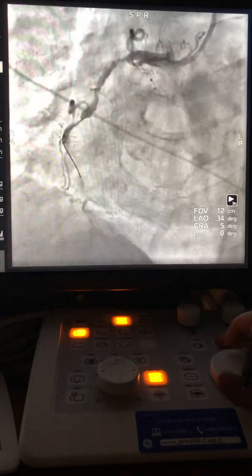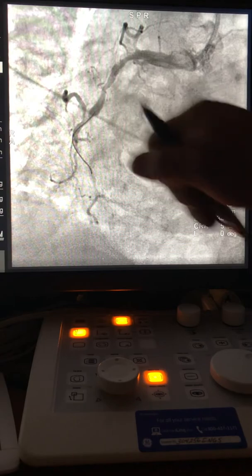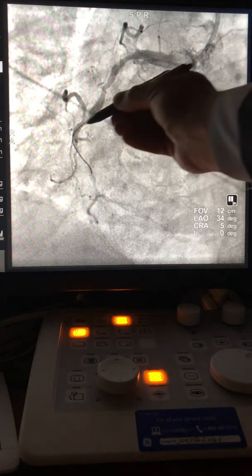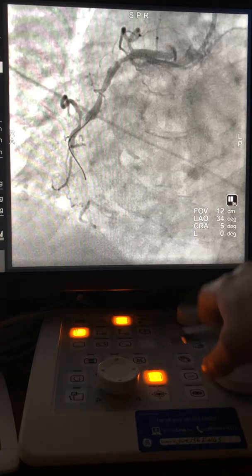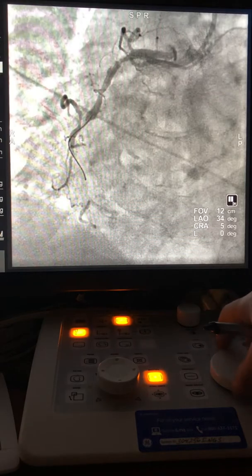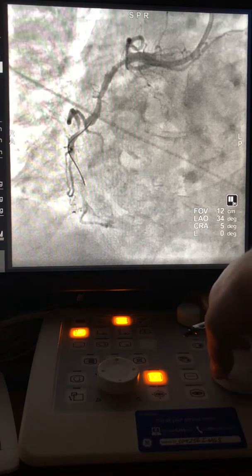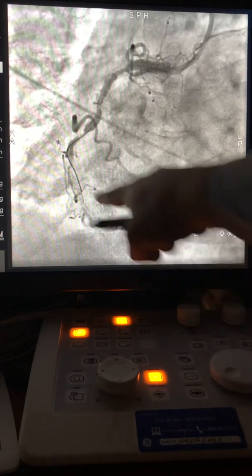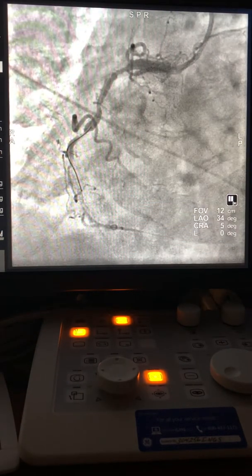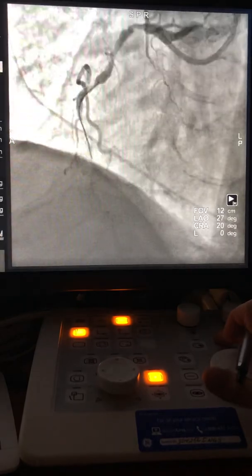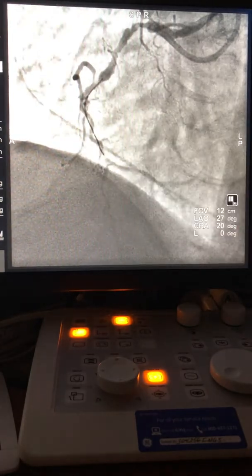Once we dilate, I have to use a smaller balloon — from 2.0 went to 1.25. The 1.25 and 1.5 balloons have one dot; 2.0 and above have two dots. Now you see the wire advancing better here, better here. Then you spin slowly, advance the balloon slowly, spin slowly, and take pictures in different projections until you make sure you're in the true lumen.